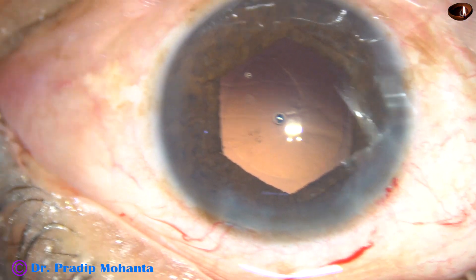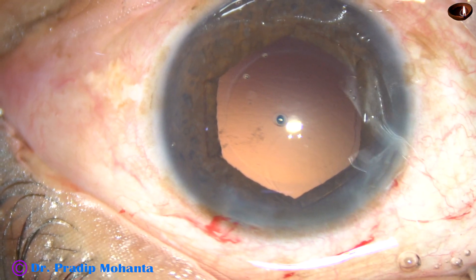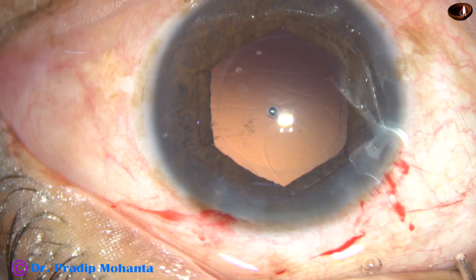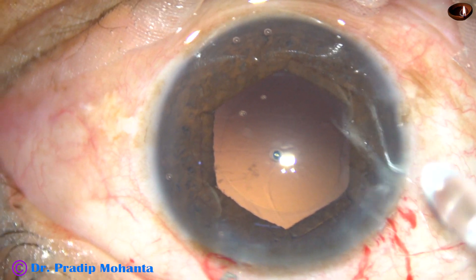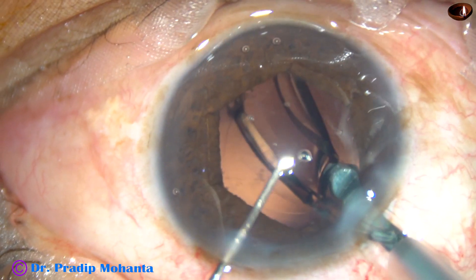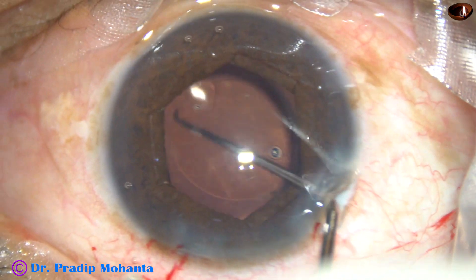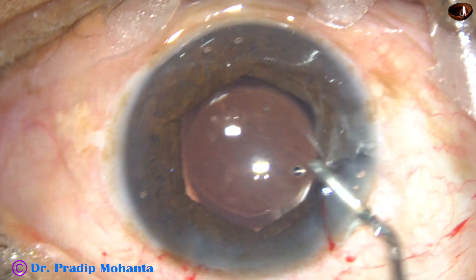Now HPMC viscoelastic is injected again for implantation of the intraocular lens. Though hydroimplantation can be done, it is better to use Viscoelastic because we have to remove the B-hex with the help of Viscoelastic filling the anterior chamber. And here goes the intraocular lens. The main incision has been enlarged a little bit because this is a B cartridge. The lens has gone into the capsular bag.